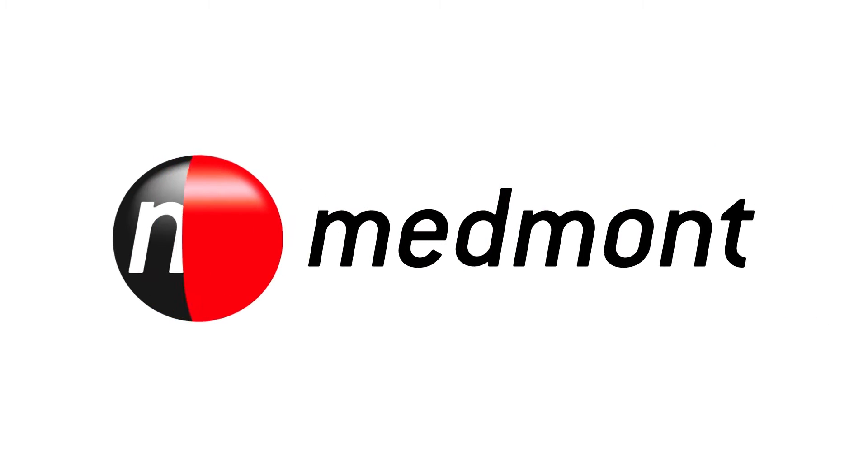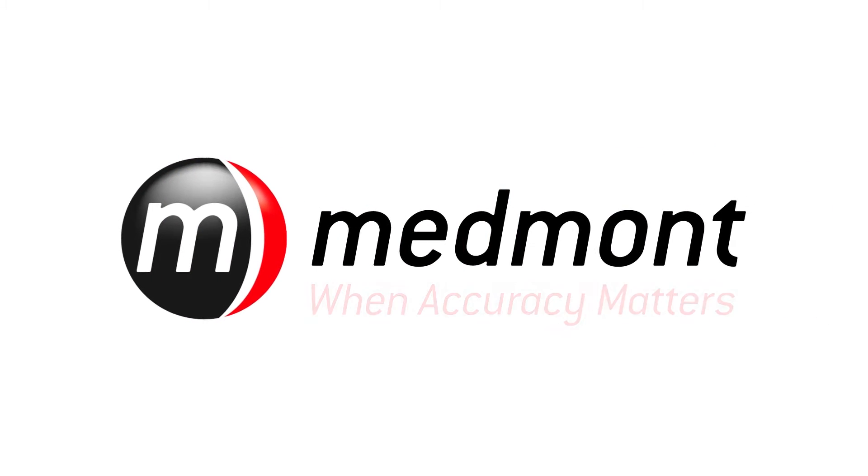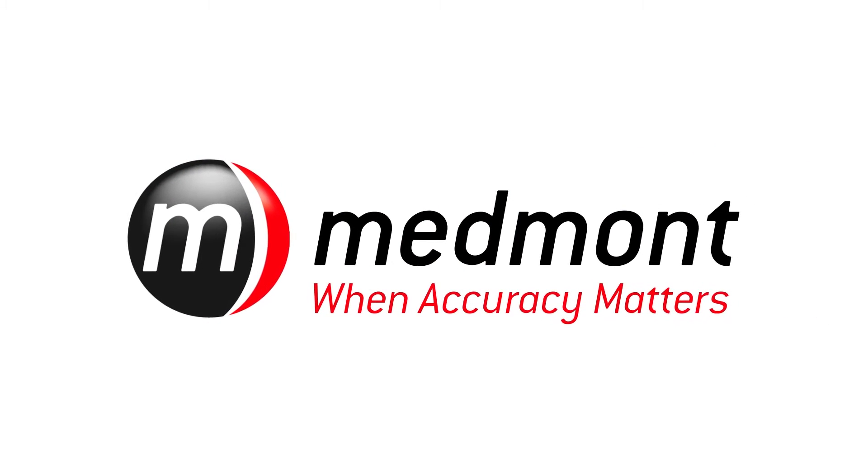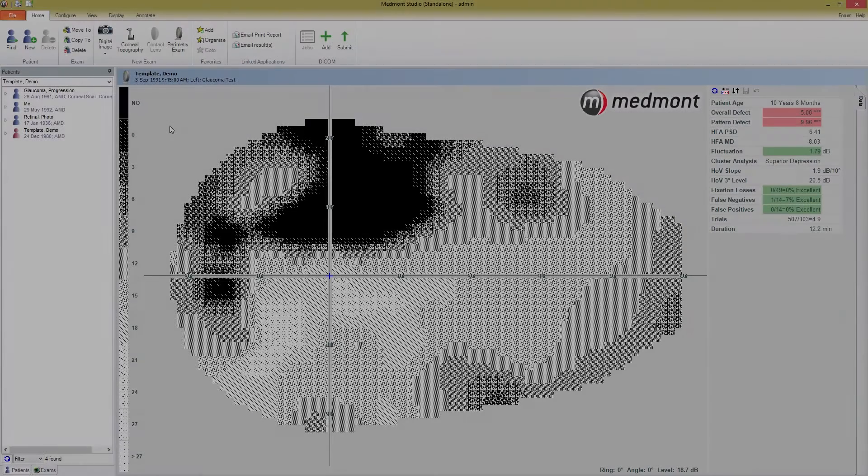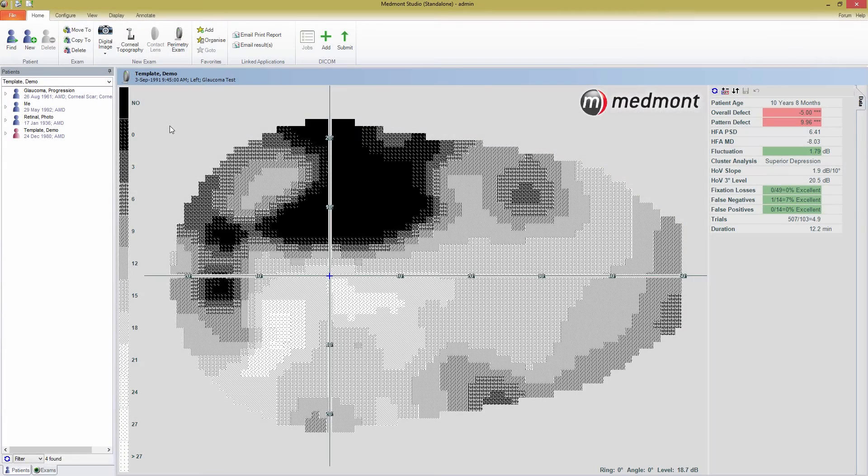Hello and welcome to Medmont's M700 tutorial videos. In this series of tutorials, I'll be showing you around the Perimetry side of Medmont Studio and how to use your M700. In this video, I'll be discussing the basics of starting an M700 test.